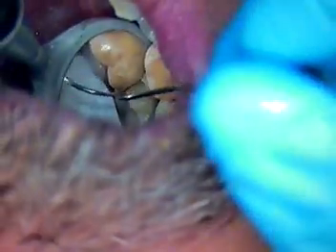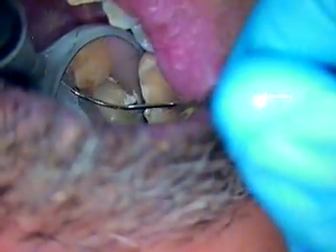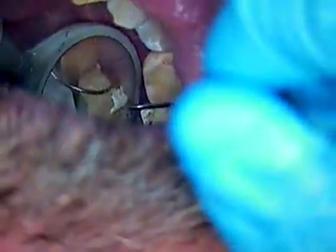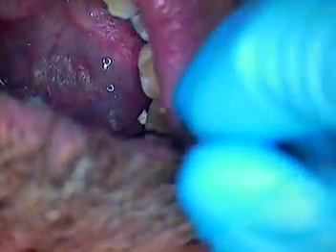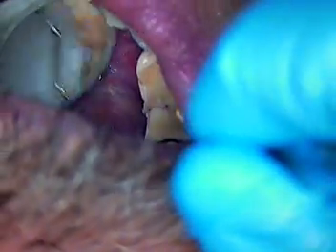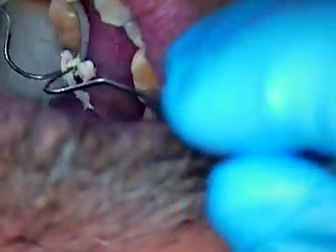Now you can see it's almost like taffy — it's a chewing gum consistency. Now you can pull it in one direction. I usually like to go horizontal so we don't pull anything off. It's still in a doughy, almost doughy consistency.